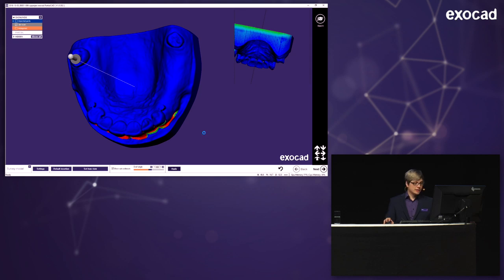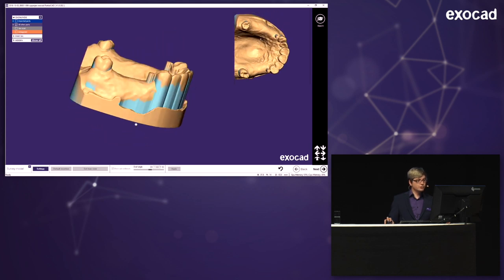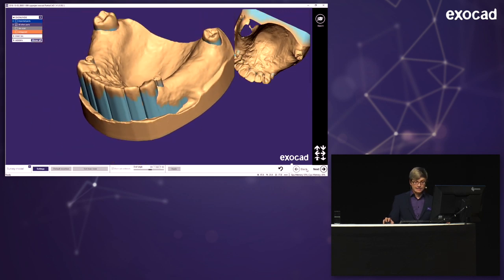Obviously, we have the draft angle, as you might have seen, at 0 degrees. But many people say, I want 1 or 2 degrees. It's a bit of a subjective taste, what you want to have. And now you have your model refractory. See here in blue the block out. And I can edit this, actually, in the next step.